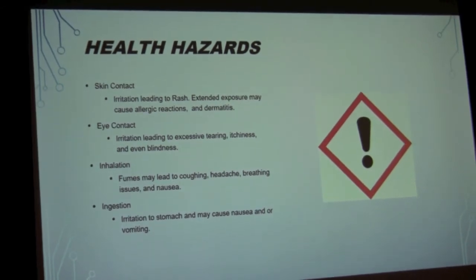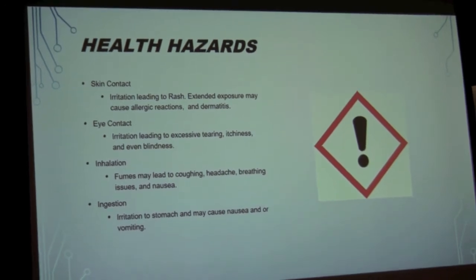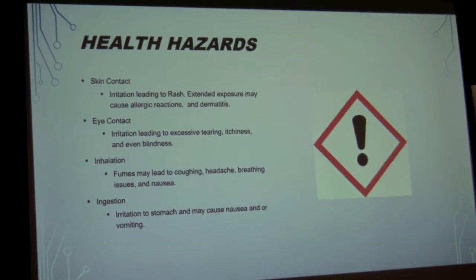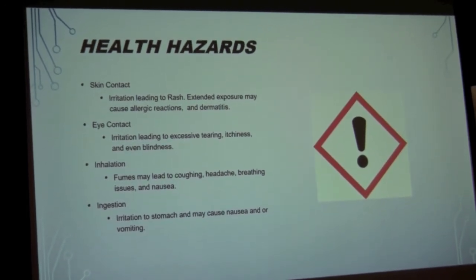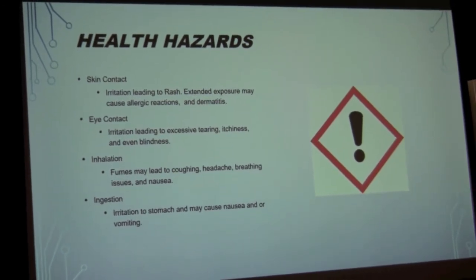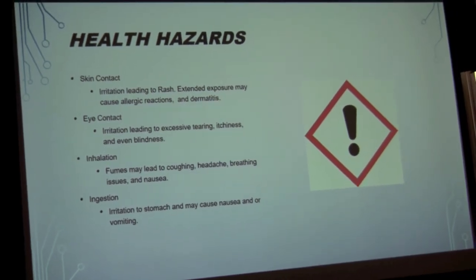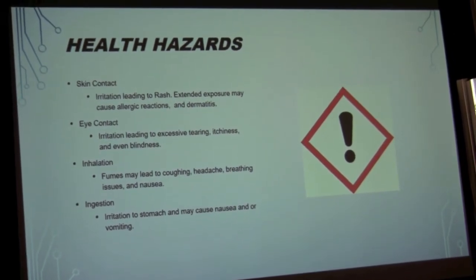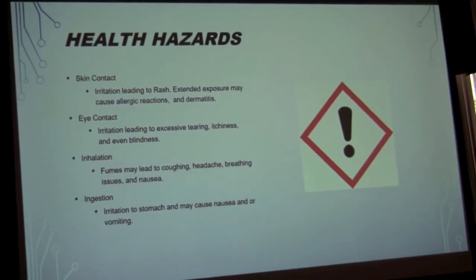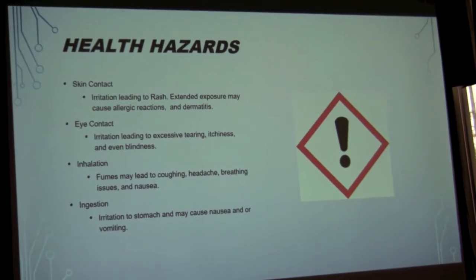Who all here is using Formlabs model resin? Have you ever smelled it? Yeah, it smells pretty bad, doesn't it? Essentially, to break down their photo initiator, they have to use a solvent of some sort. And so that model material has a high solvent content. It actually smells flammable. I mean, it smells really bad. So you don't want to breathe it in. You don't want to stand there and huff a tray of resin. And then, of course, you don't want to drink it. It's really harmful stuff. I know this seems kind of common sense, but you'd be surprised.